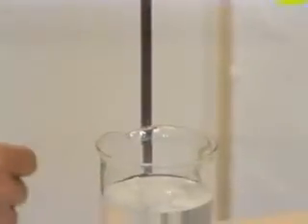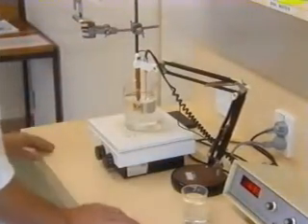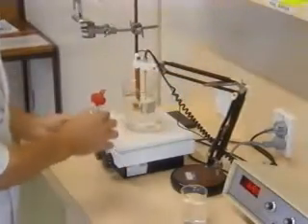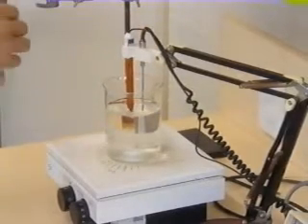To this mixture, sugar is added and the pH is checked. As a general rule, the pH of tissue culture media is adjusted using either a weak acid solution like 1 normal hydrochloric acid or a base like 1 normal sodium hydroxide.